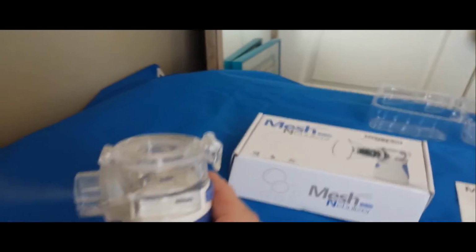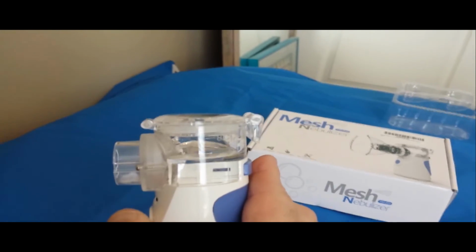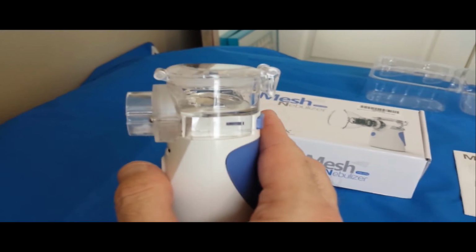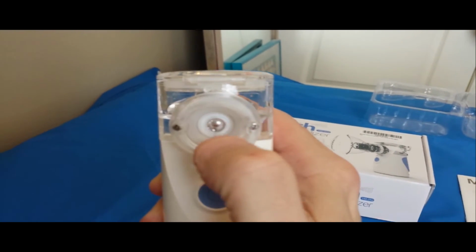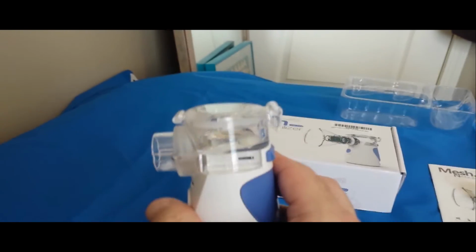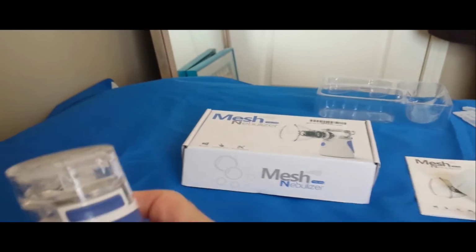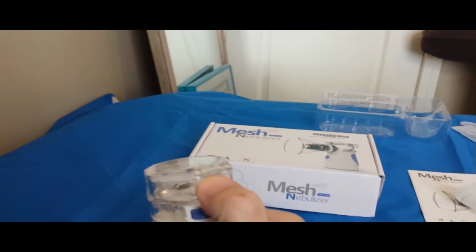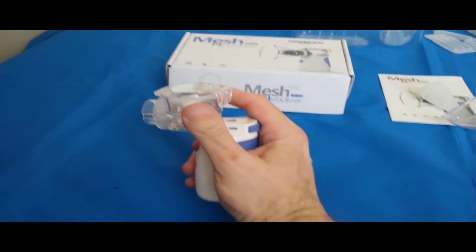You also need to make sure that when you run it, you have liquid inside of it. If you don't have liquid inside of it, it will turn off automatically to prevent that piece from burning up by running it dry. So again, to remove the upper piece, you push this button in, and then this top part slides off. Okay.